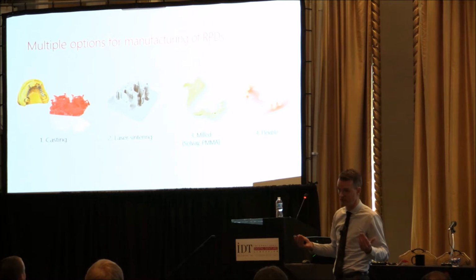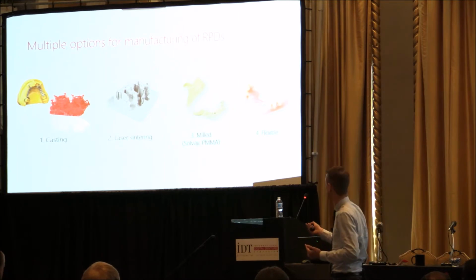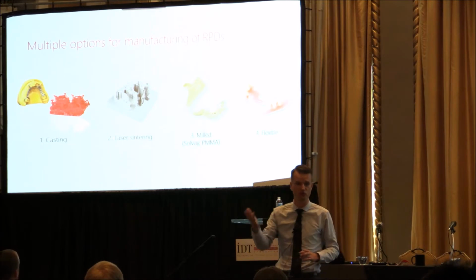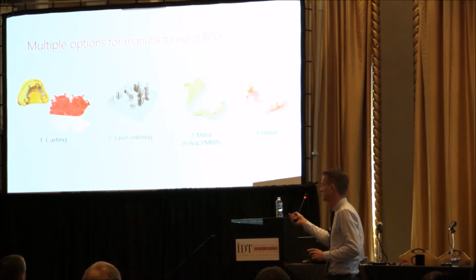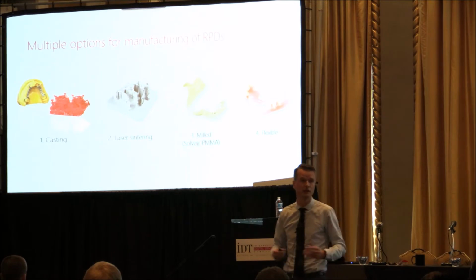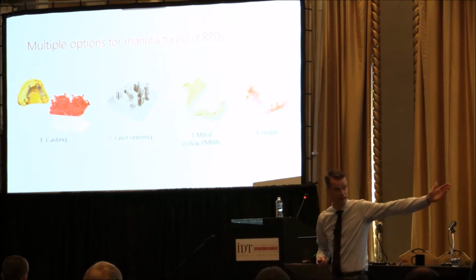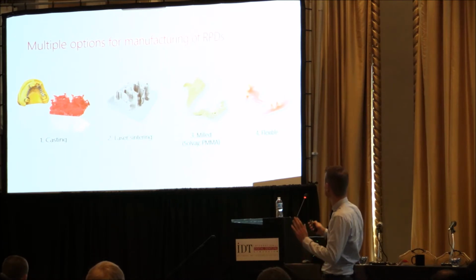And you might be able to bring removable frameworks back into your lab again instead of outsourcing it to China. There are quite a lot of people in Europe that are actually laser sintering. There's also a 3D RPD here in the US. I don't think they really took off, to be honest, but there are quite a lot of people in Europe that are laser sintering. You can, of course, also mill, as we saw yesterday, PMMA, like Justin showed yesterday, or Solvay, as we have in here. And there's also a possibility to do flexible workflows.